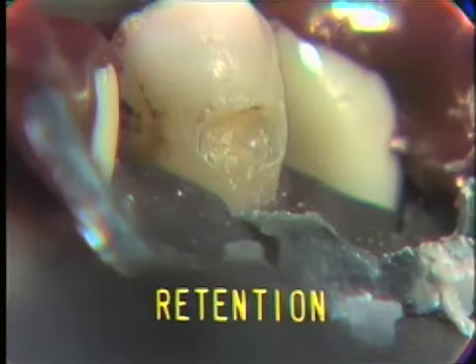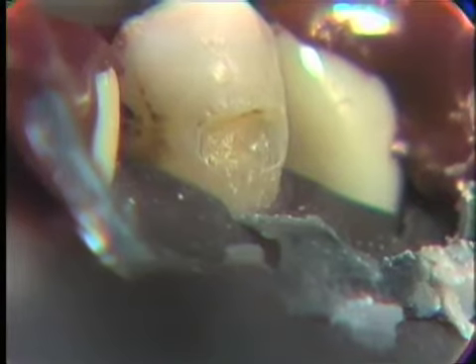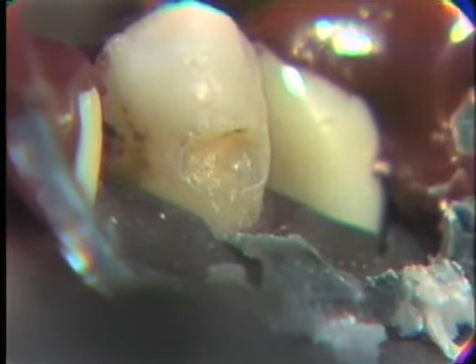Now, students have difficulty putting retention in because of the lack of understanding of the application of the burr. It is not necessary to cut a deep trench into this tooth. It's merely necessary to cut a groove that would be, in this case, half of a quarter round burr on both the occlusal and the cervical walls, not cutting into the mesial and distal.